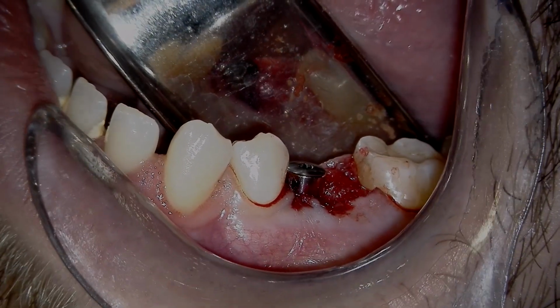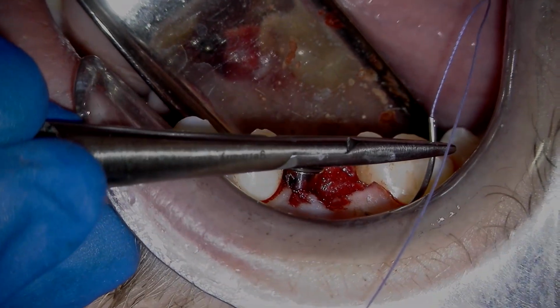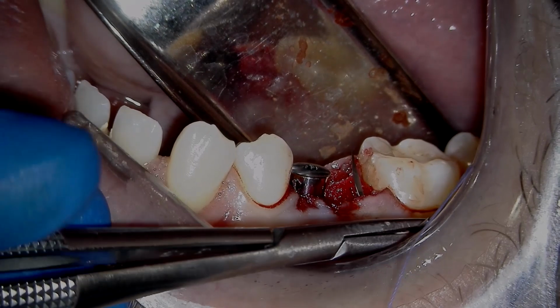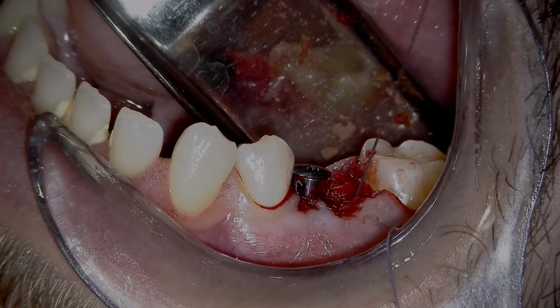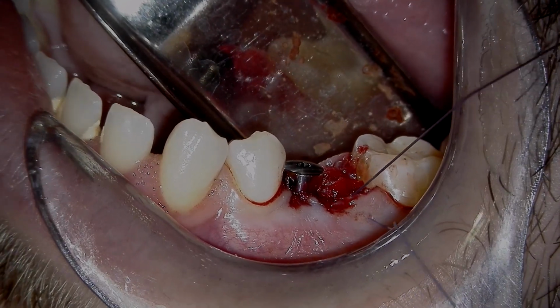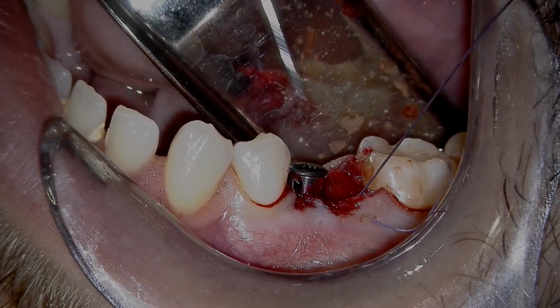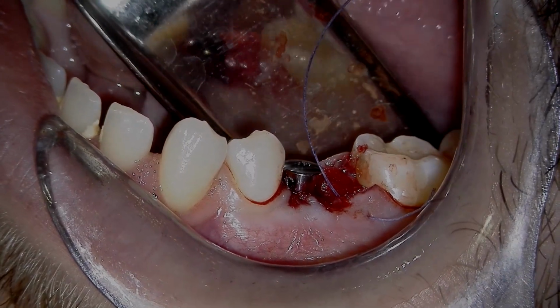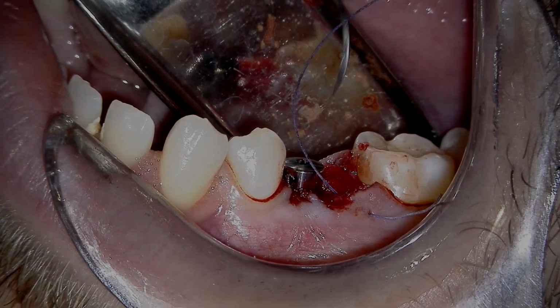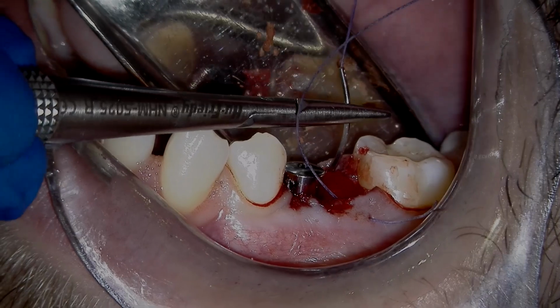Now on the distal side, we want to be careful not to lift up the membrane. So I'm going to go buccal lingual through the buccal tissue and kind of come up just like that and kind of split the difference between the gum tissue and the membrane. I'm going to lift it up by pulling it out towards the buccal, not towards the lingual, because that will disturb that membrane. Now I'm just tucking that back in so it stays tucked down. And then I'm going to go through the lingual tissue from a buccal lingual direction and try not to disturb the membrane.